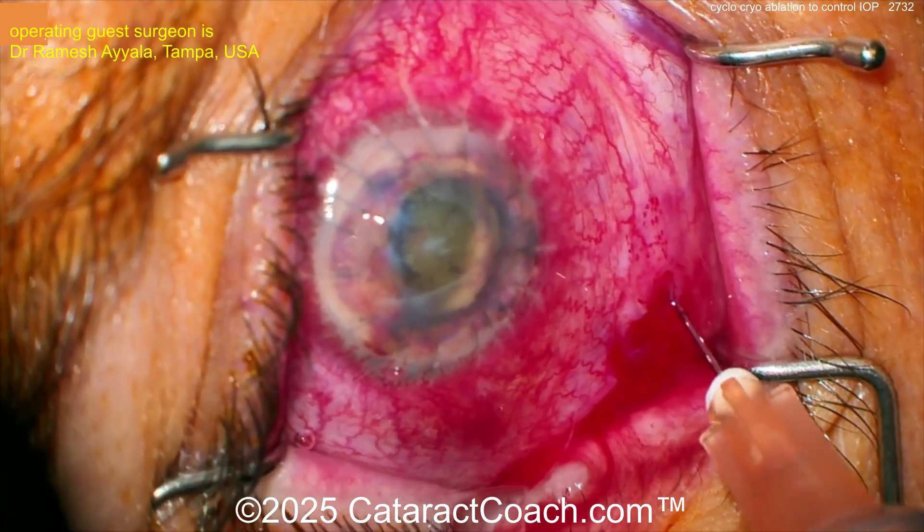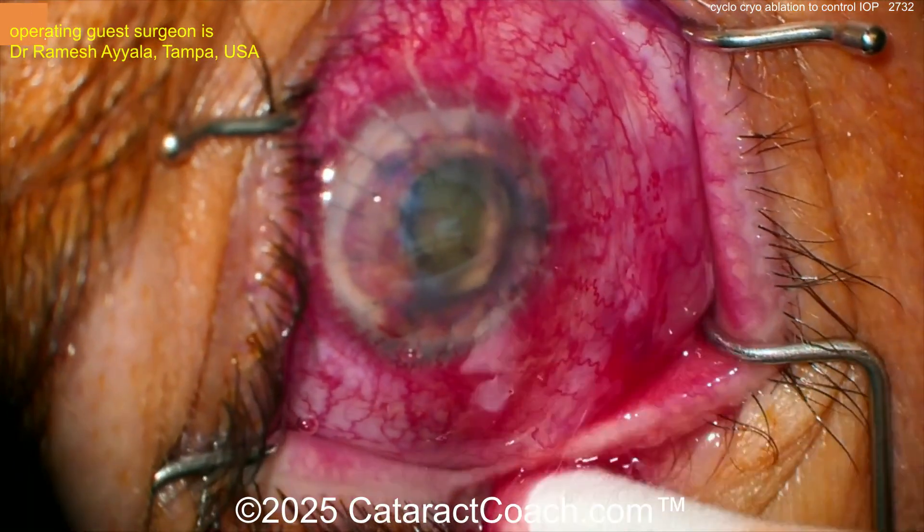Treatment options are limited and you're not sure if the fungal infection is still active. So here comes a retrobulbar or peribulbar injection of lidocaine and epi. That's going to reduce some of the post-op pain, and maybe even add some Marcaine in there.